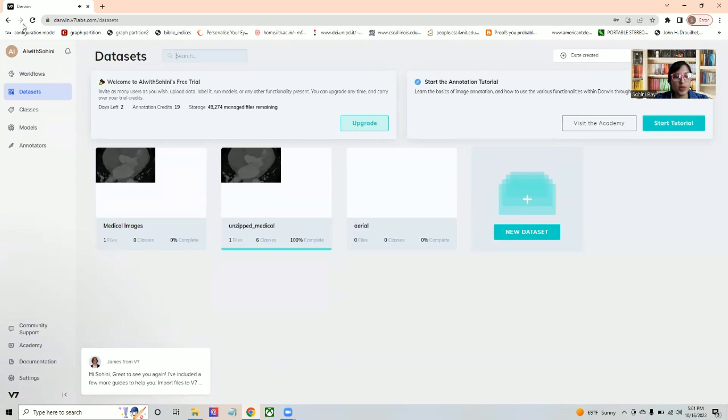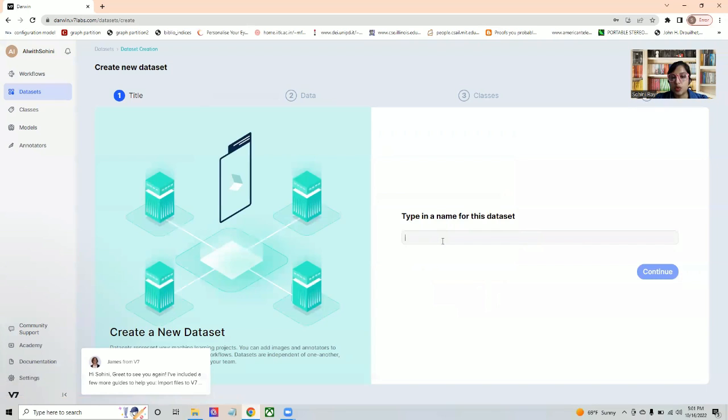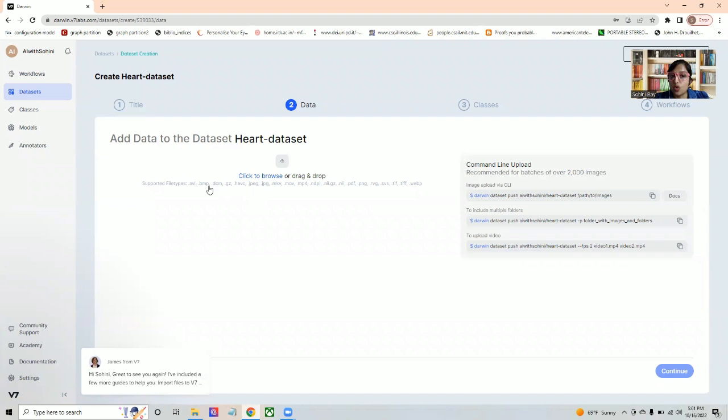The first step is always to add a new dataset. Let's say that I am going to be starting with the heart dataset and I hit continue. As you can see, all the different file types that are supported is all video, as well as most of the DICOM or the medical image formats that's required. If you are doing this through CLI, command line interface, using Python, then it gives you all of the commands that you can use as well.